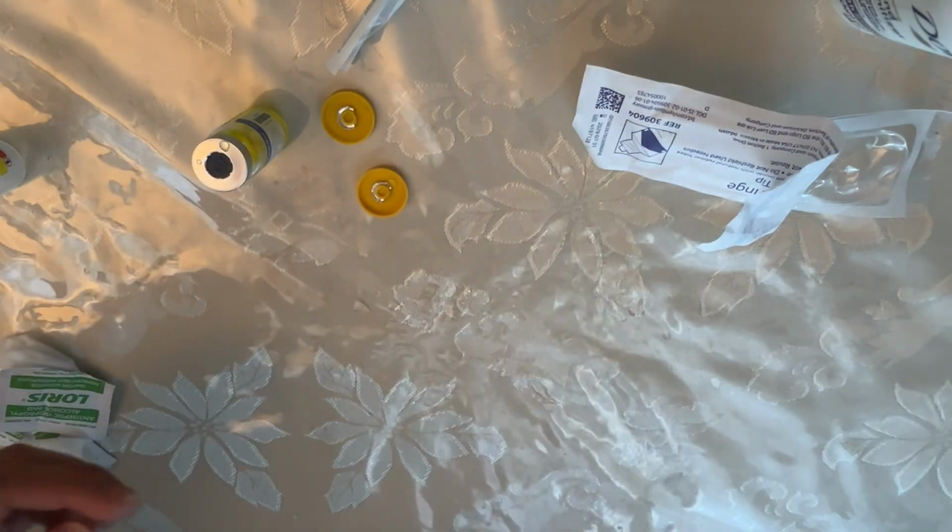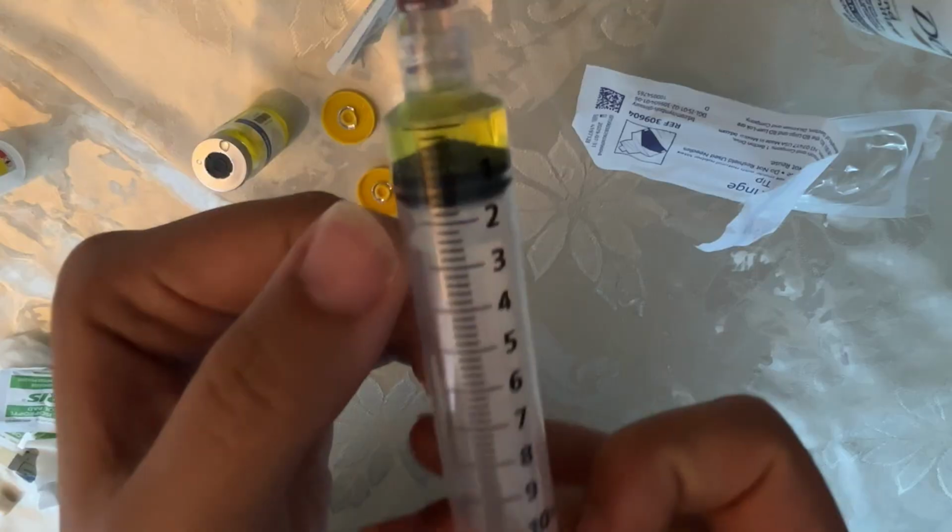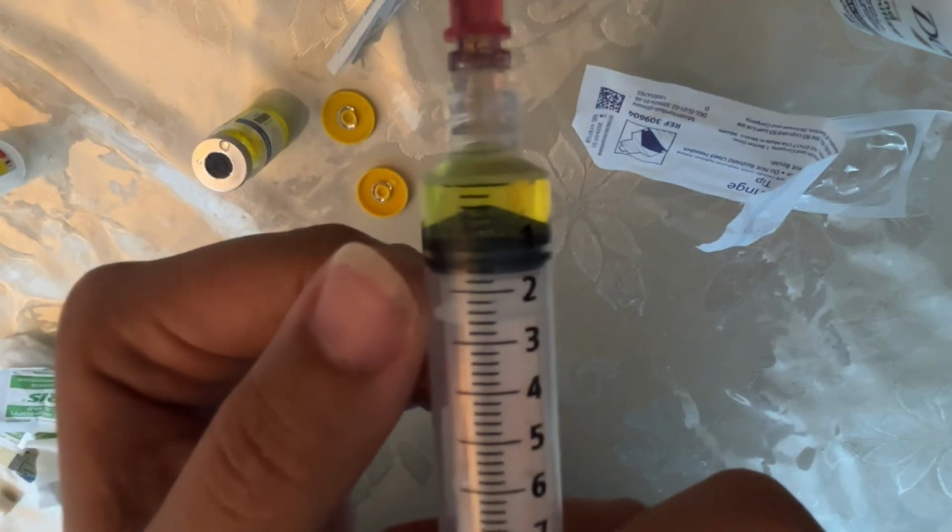Just going to go ahead and remove the bubbles and set the medication to the desired dose. So I have to withdraw 1 ml, so I need 1 ml. So right now I have 1 ml of the medication.